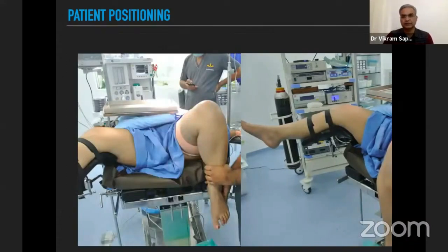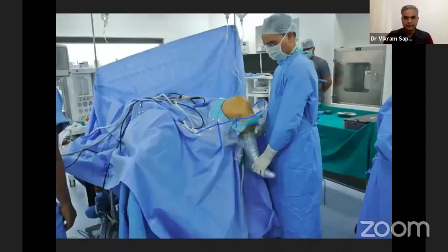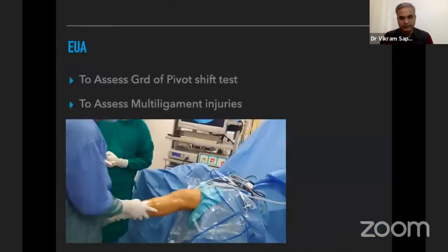Once the patient is positioned, we need to check whether we are able to get full flexion — the flexion required for femoral tunnel drilling — and also check once the patient is fully draped. After positioning, we examine the patient under anesthesia to grade the pivot shift test.